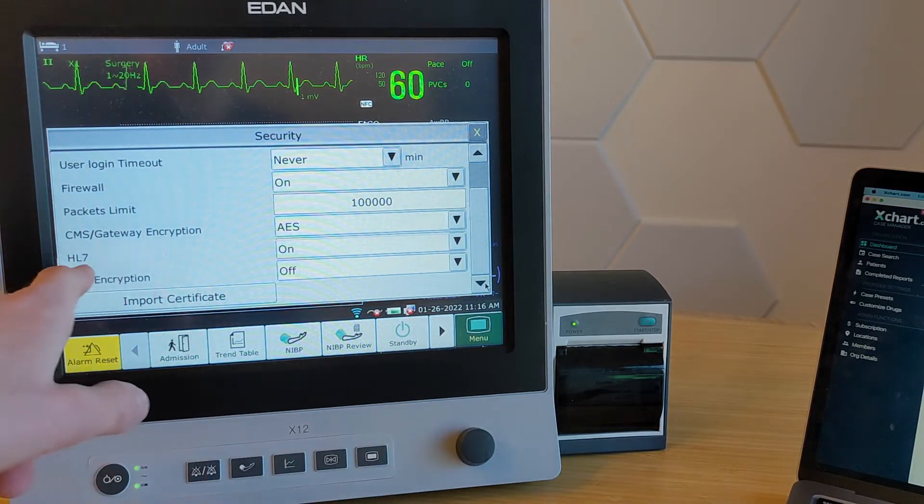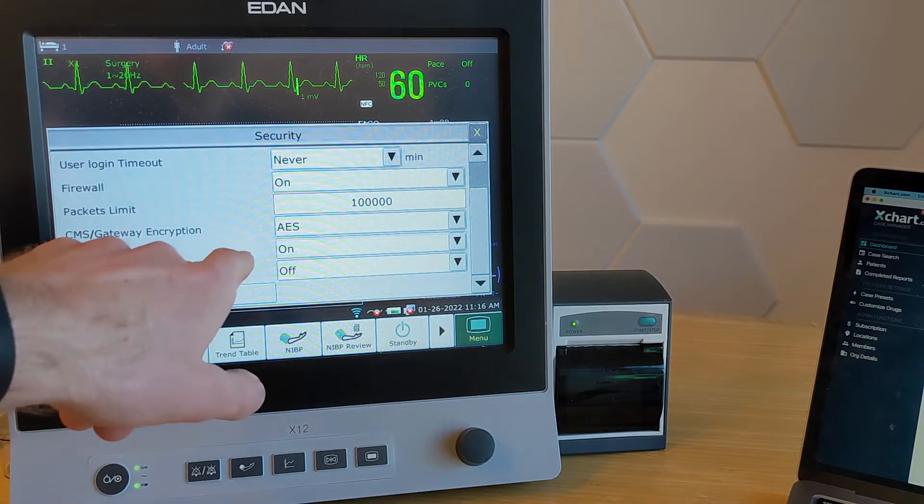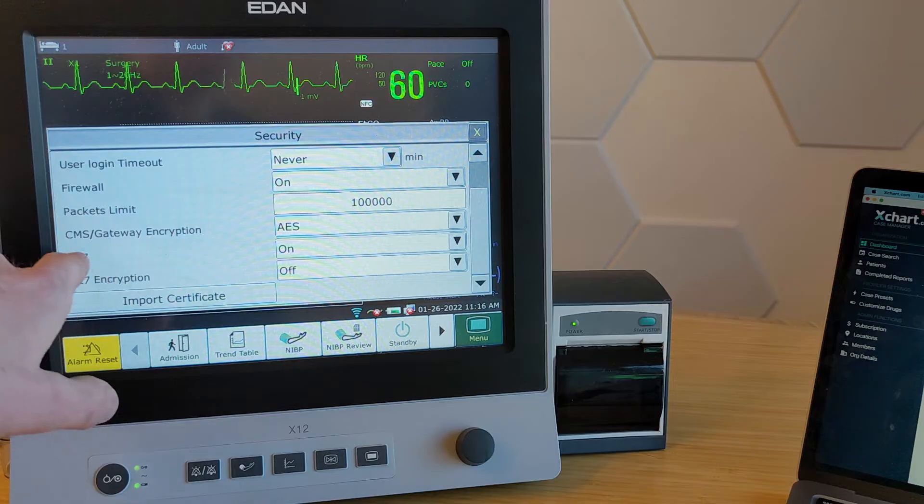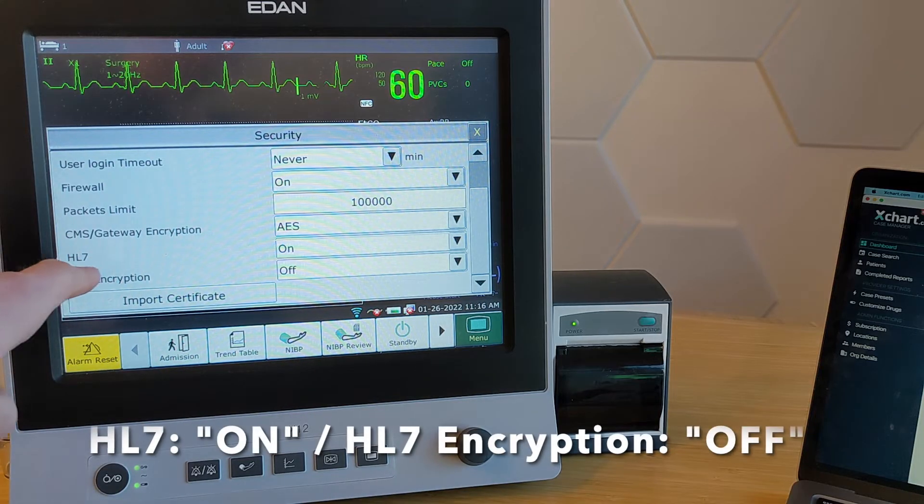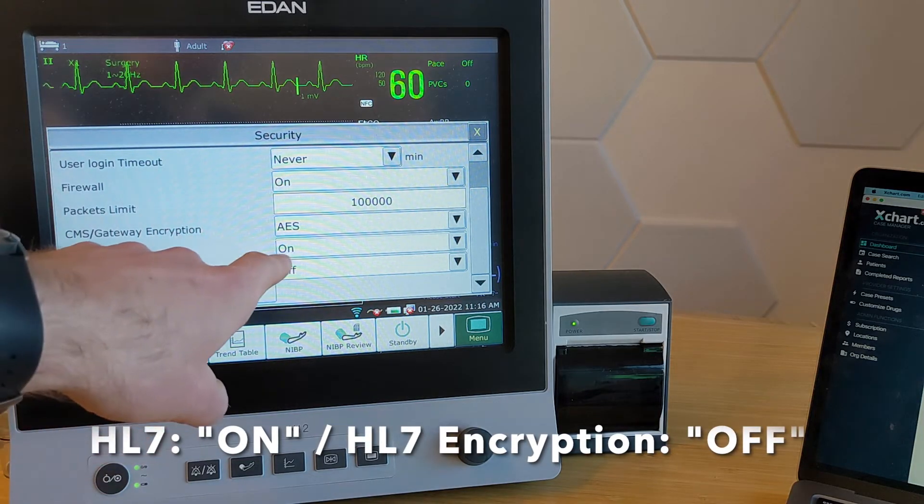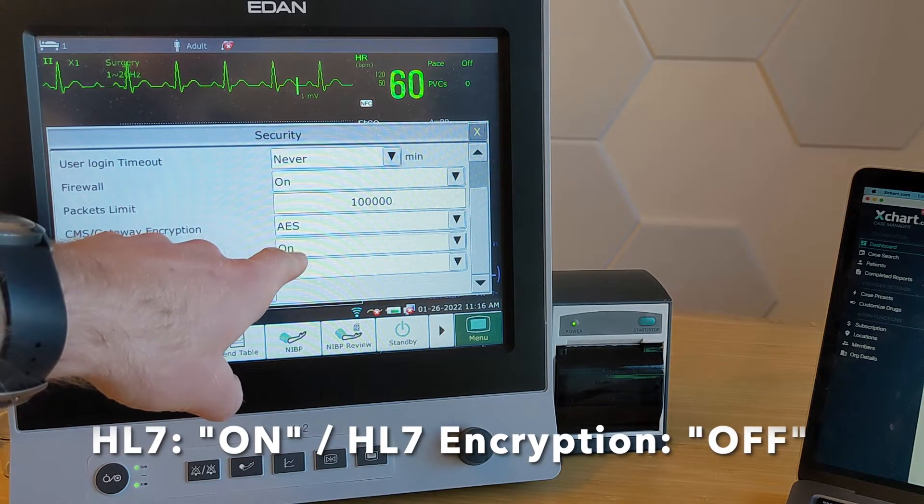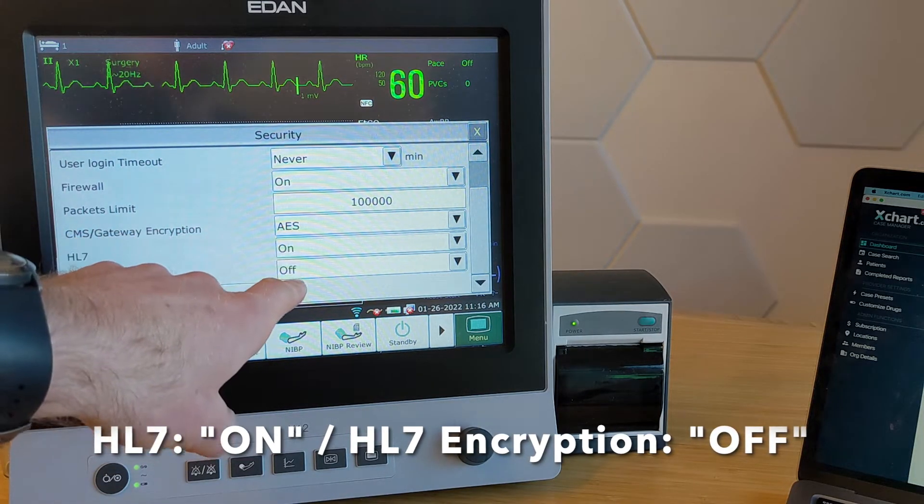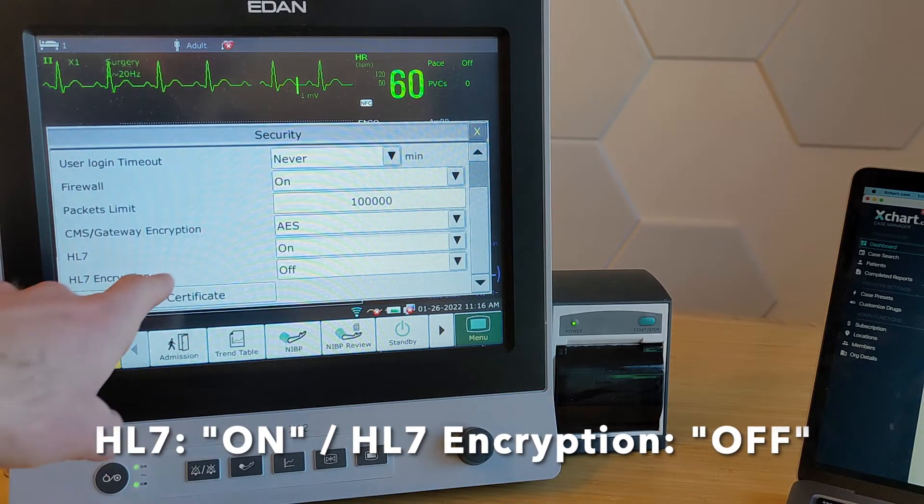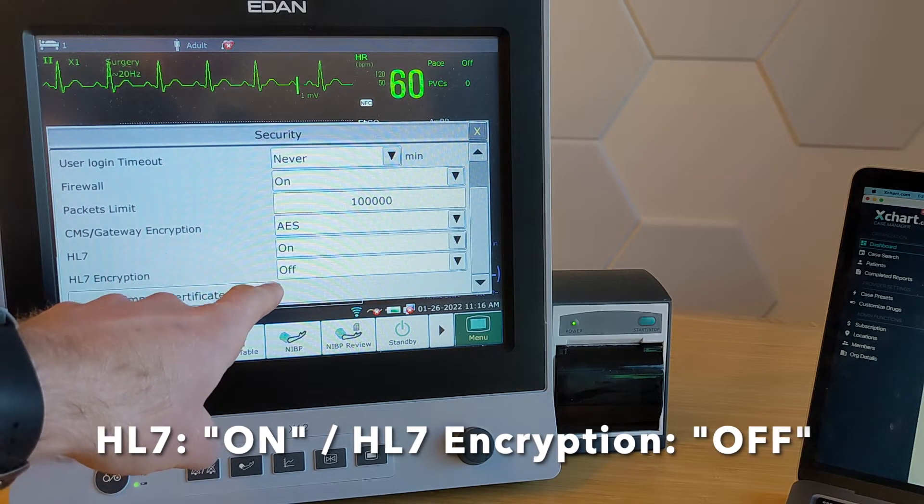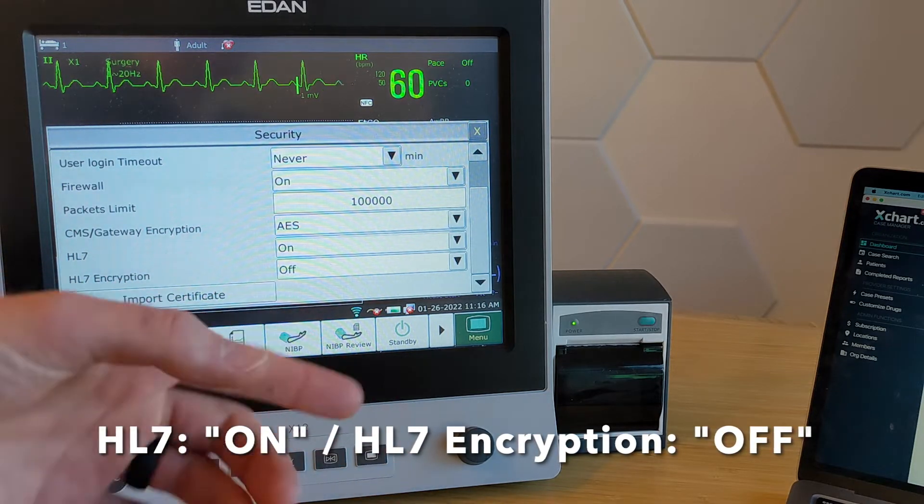And what we're going to want to do is make sure that HL7 right here, the two bottom ones are the ones that matter. So HL7 has to be set to on, and HL7 encryption has to be set to off.